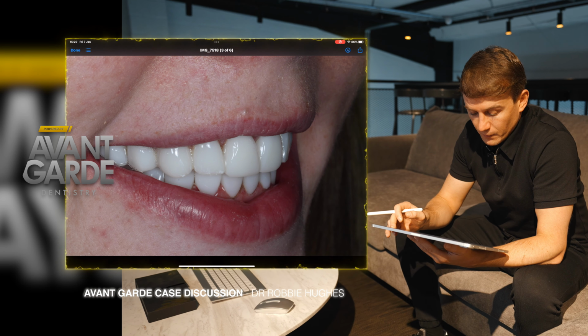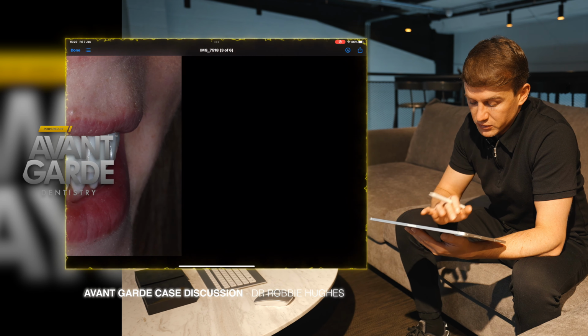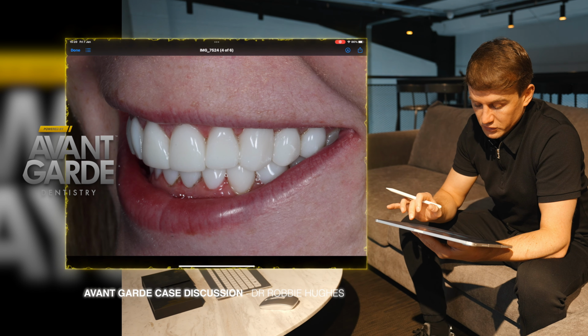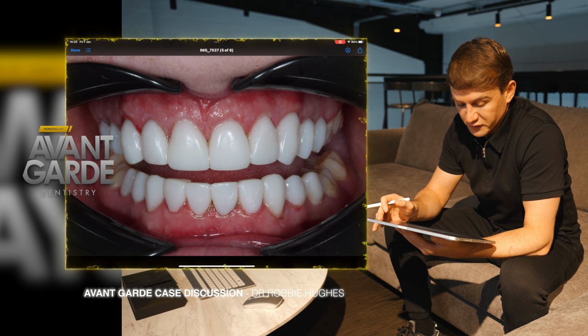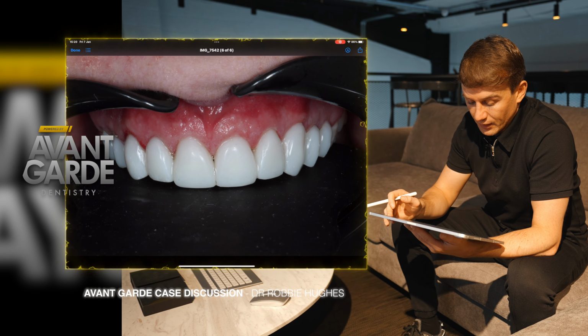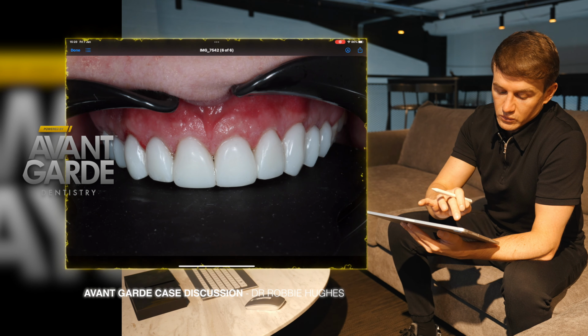Side view. Again, great volume to the smile. Nice shapes and portions of anatomy, which we didn't have before. Other side view. And you can see the lowers all nicely finished off there as well. These photos were taken on the day of treatment and a close-up retracted.